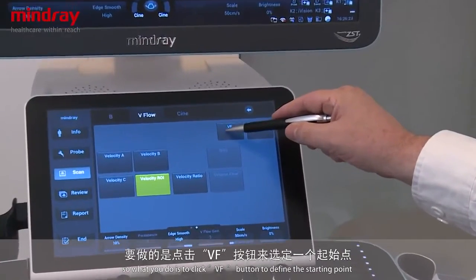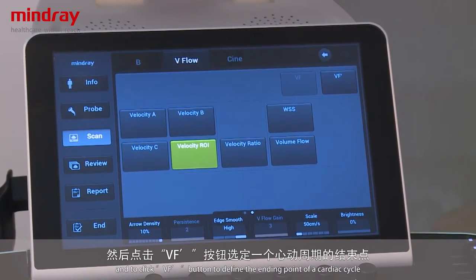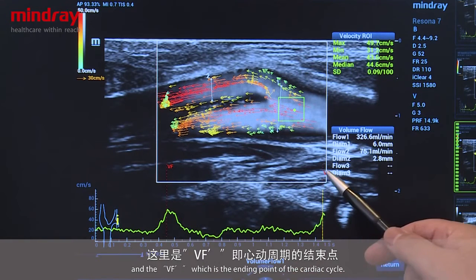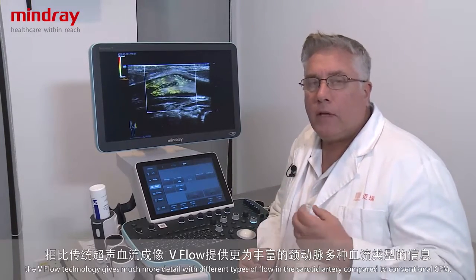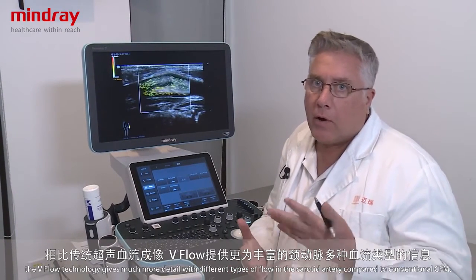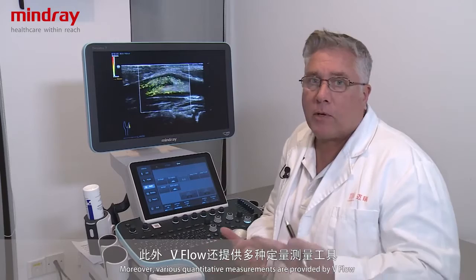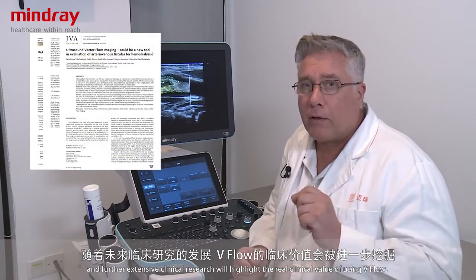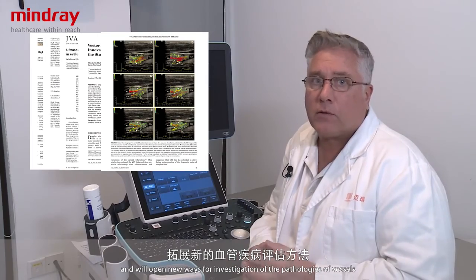To define the cardiac cycle, click the VF button to set the starting point, then click the VF prime button to define the ending point. VF marks the beginning and VF prime marks the end of the cardiac cycle. As you can see, V-flow gives you much more detail with different types of flow within the carotid artery compared to conventional color flow mapping. Various quantitative measurements are provided, and with further clinical research, this will highlight the real clinical value of V-flow and open new ways for investigating pathologies within vessels.